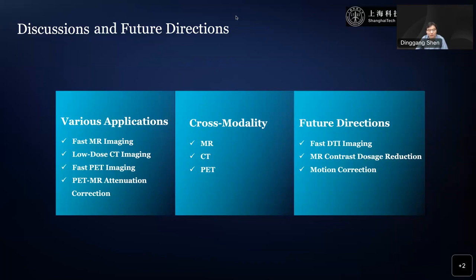Actually, in 15 hours, we scanned 268 scans and covered 10 organs, and each scan took about 3.5 minutes. Of course, you can say maybe the current deep learning algorithm is not enough to cover all cases, for example, very small lesions. But if you remember, I mentioned that we used 2 million images for training our algorithm, a large set of data.